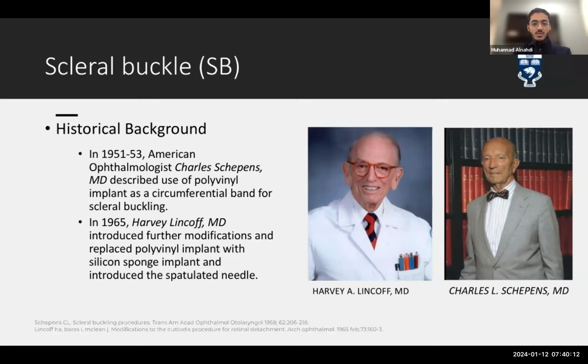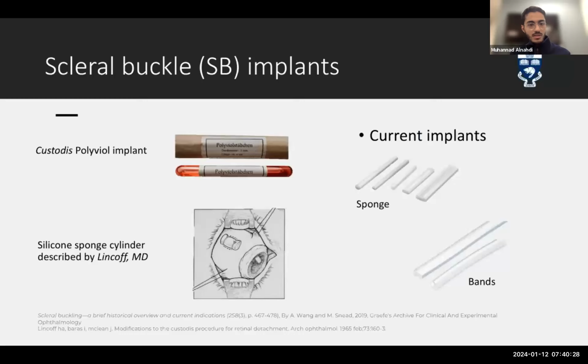There were cases of extrusion, endophthalmitis, and inflammatory reaction that came from the first implant that was ever introduced. And here we have an example.